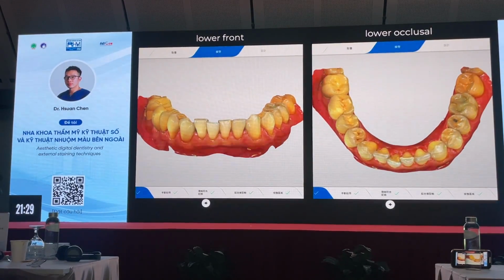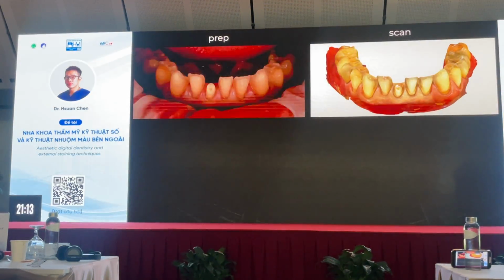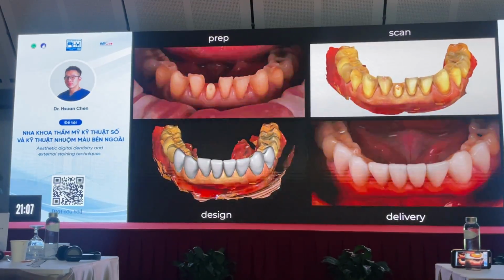So I tried to convince him to do micro-orthodontics, where we can move it in about 2 months or so. But he cannot do orthodontics because of his work. He has to speak every day. So instead we just did preventative endodontics on that tooth, and you can see that we've done endodontics. And this is the design also in-lab, and this is the delivery.